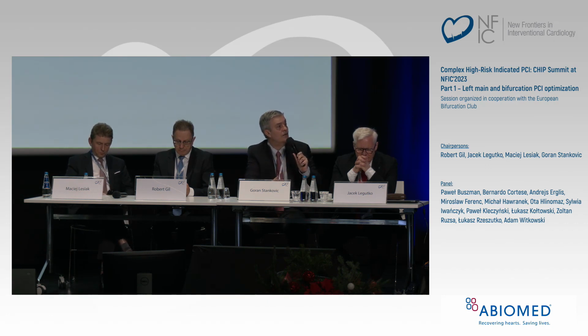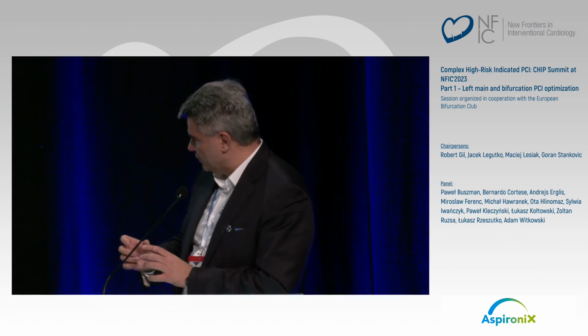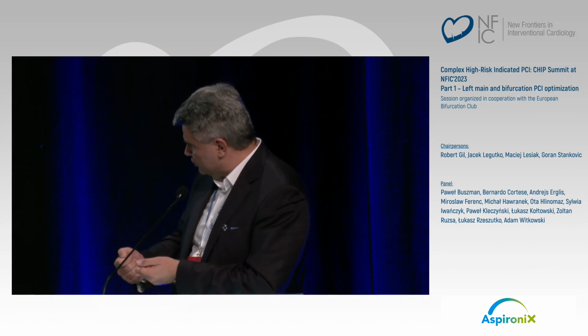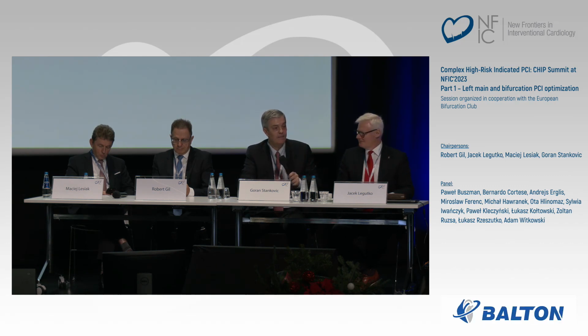This is why we say that when you need it, it's okay, and it's approximately 1 out of 5 patients. But if you do it, then you have to do it with kissing, high-pressure inflation, and if possible with image guidance. Do you believe that in the next 2, 3, 5 years we will come back to two-stent technology with newer stent technology, or is it rather the end of the story, with more imaging and more balloon? Yes, I think convincing evidence exists that optimized treatment, with good expansion and less metal, provides better clinical follow-up.